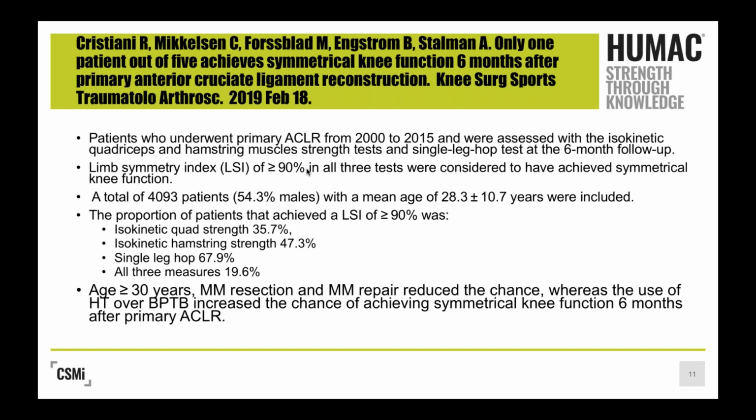Now, a few other things to note here is that the isokinetic test they performed is the standard isokinetic test that only looks at the concentric motions. Next month, John's going to tell you about the interrupted stroke test that also looks at the eccentric function, and it gives us a much better look at readiness. Now, last thing to take away here, and again, this just hits me like a ton of bricks: only 1 in 5 meet minimal return to play standards at 6 months.